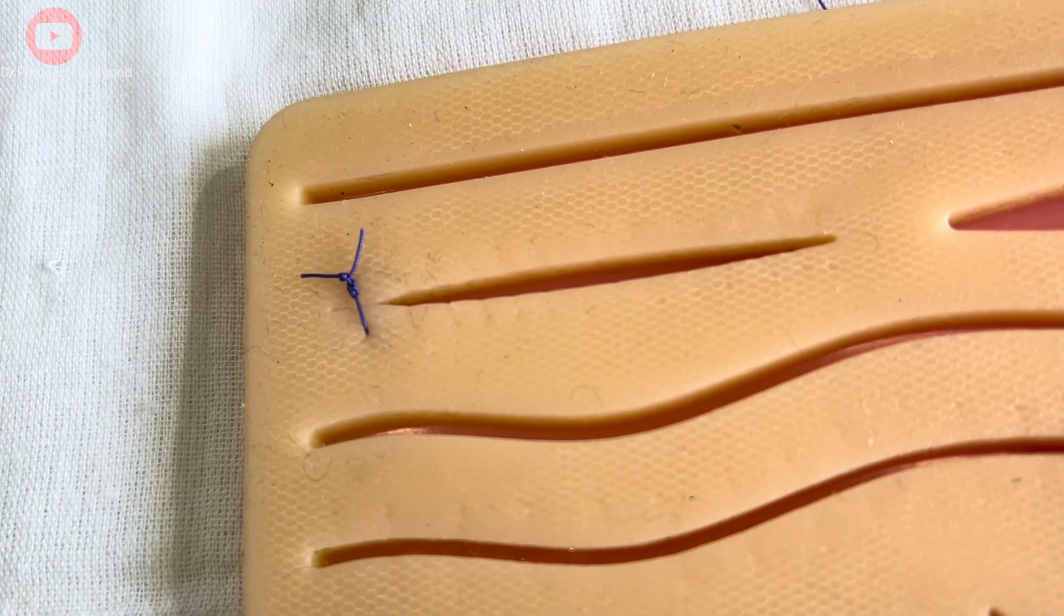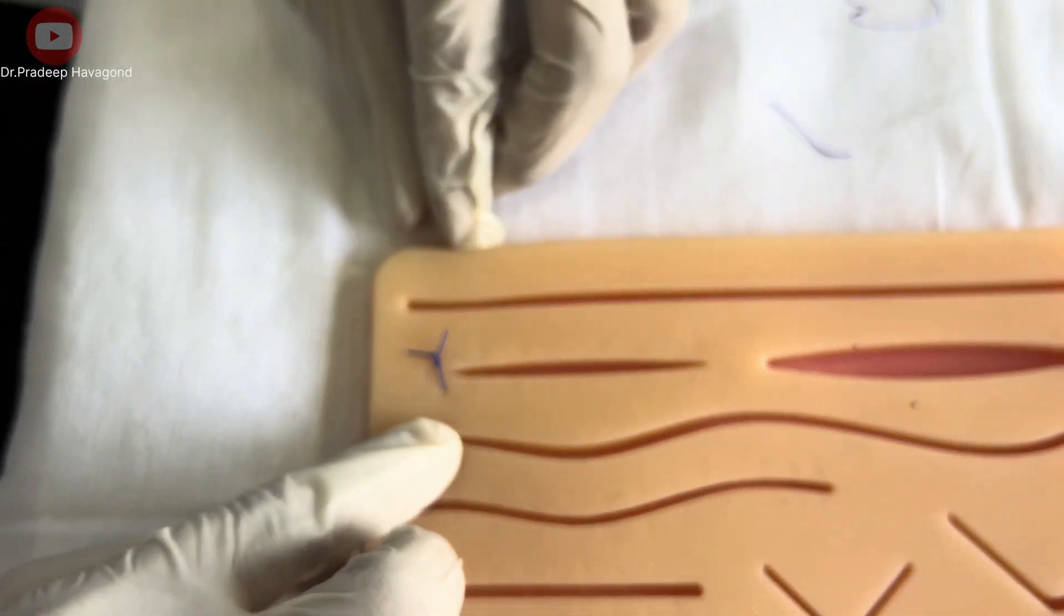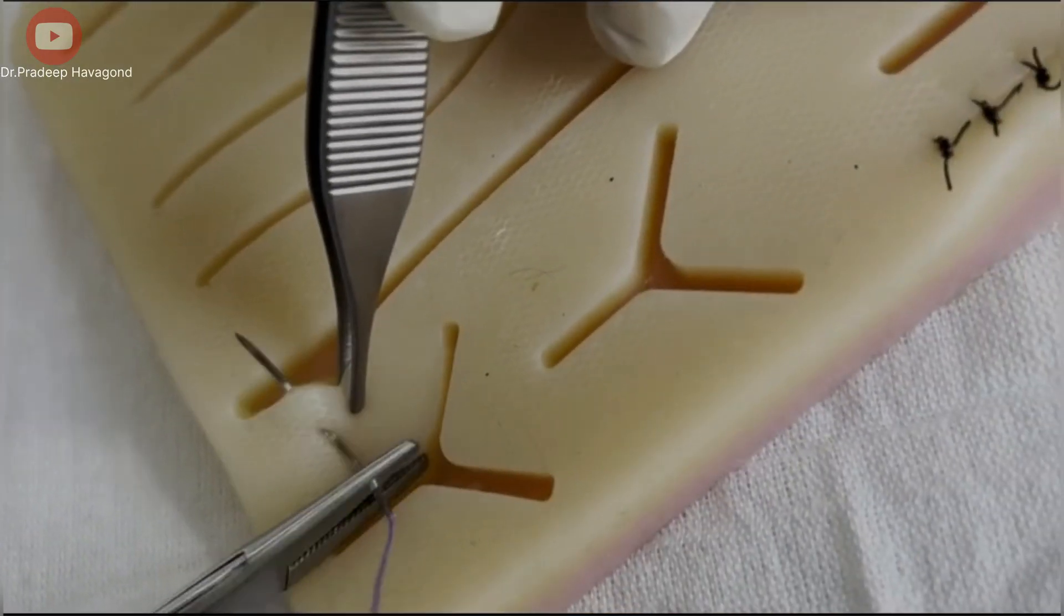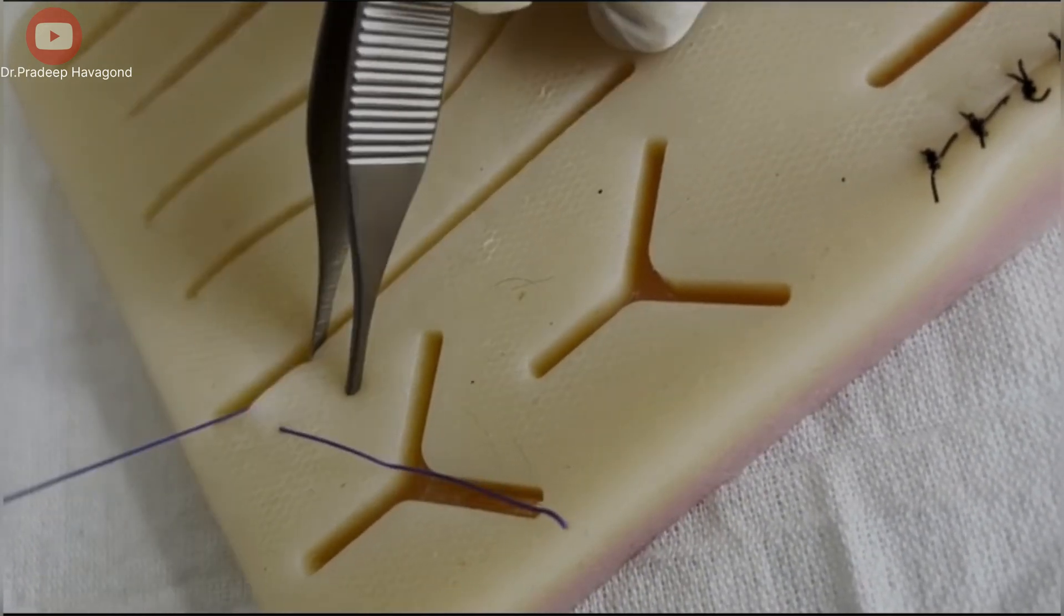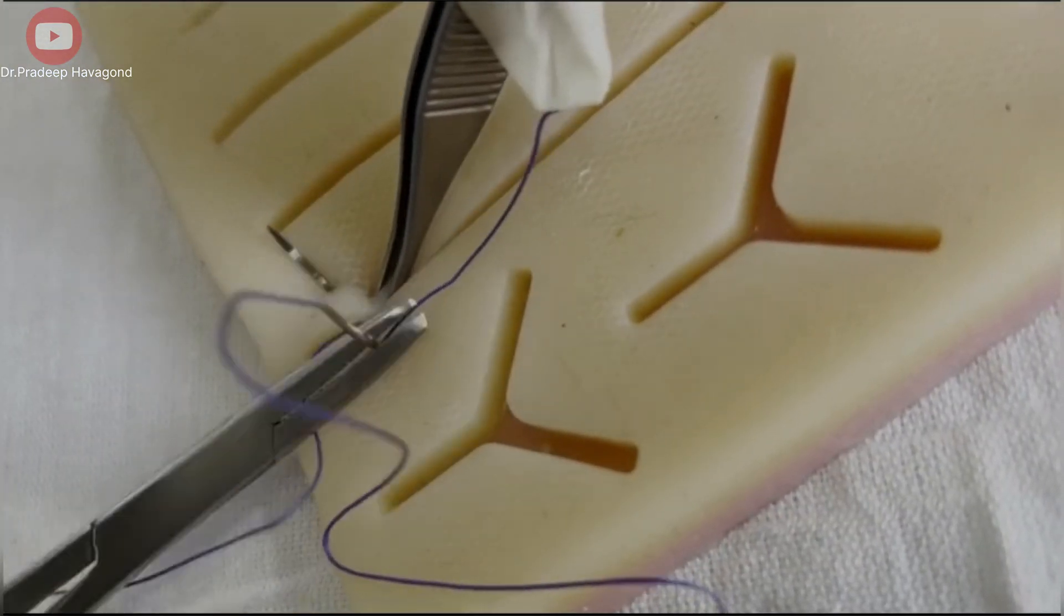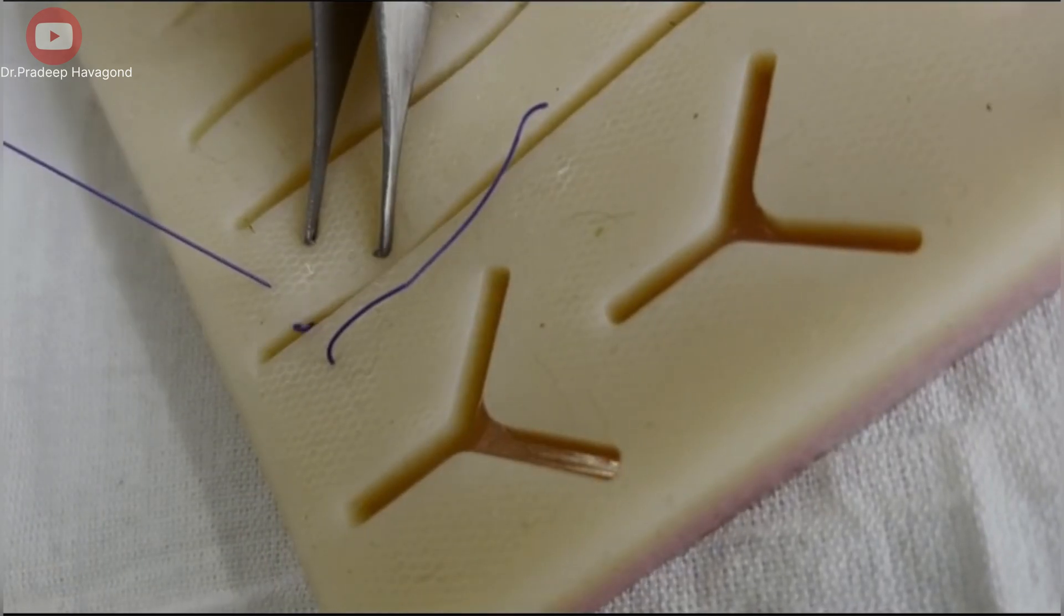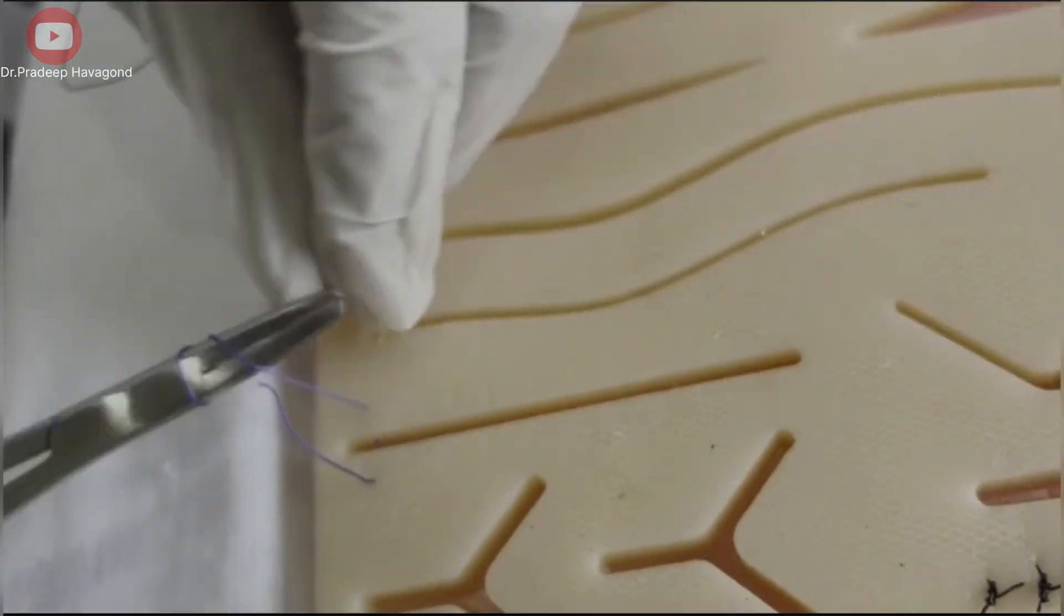And there you have it. The simple interrupted suture is one of the most versatile techniques in wound closure. It's simple, effective, and great for both superficial and deep wounds.